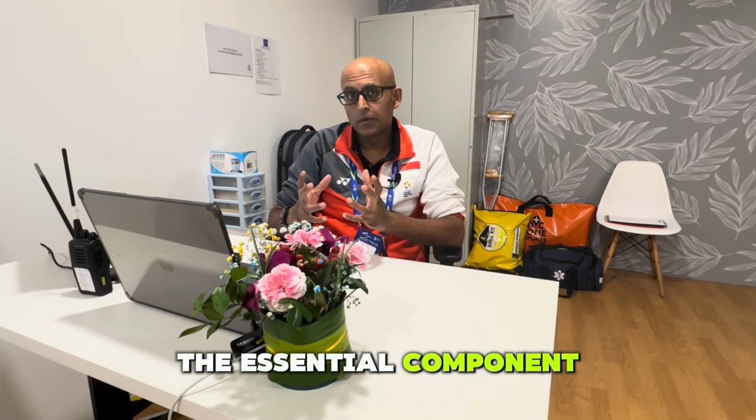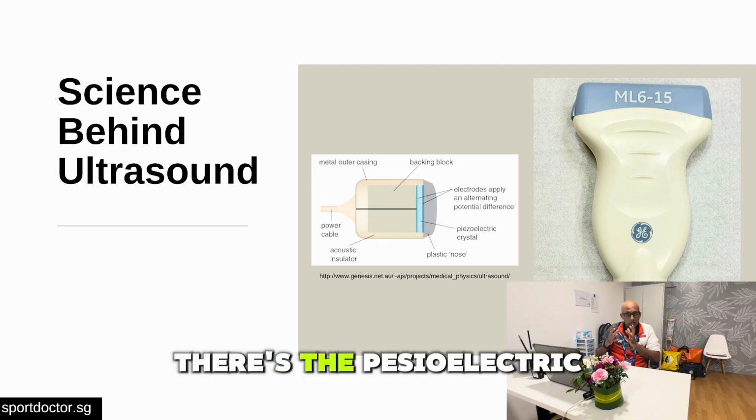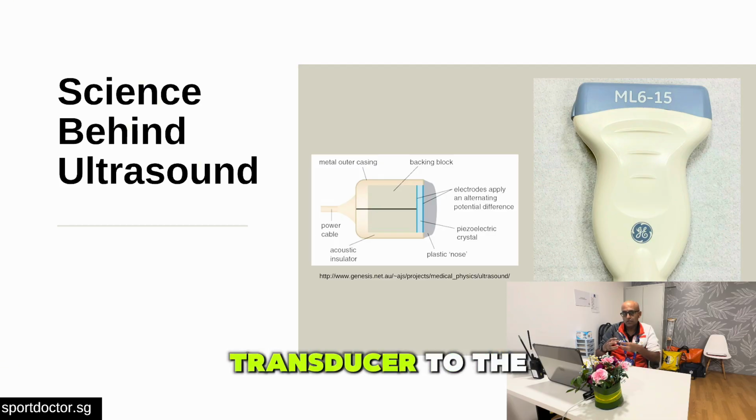The essential component in the ultrasound unit is the transducer, and we have various parts to it. There's the piezoelectric crystals at the very head, then you have the body of the transducer and the connecting cable which connects the transducer to the main unit. And this is essentially how ultrasound works.